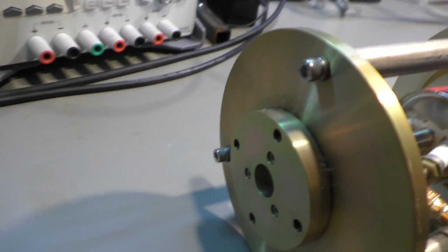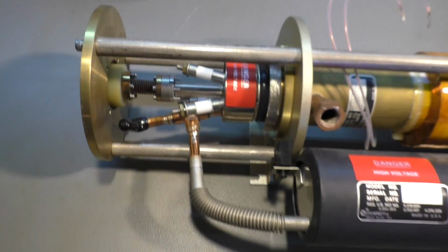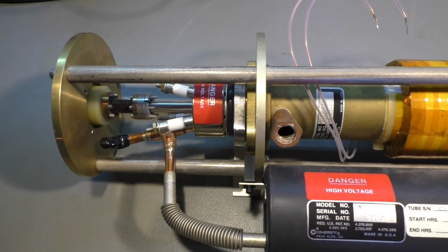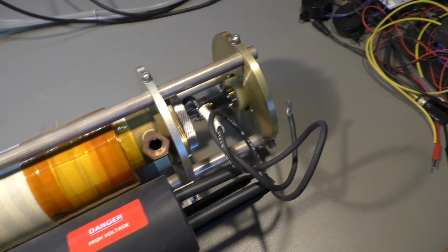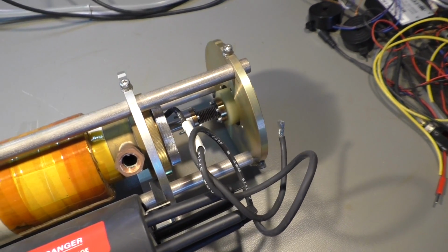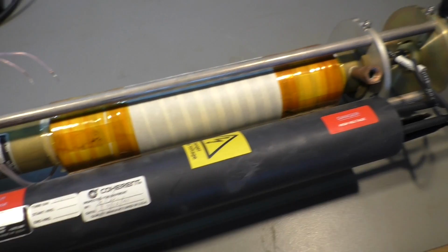There is of course a mirror on the other side. It looks about the same as the output mirror, but this one should be 100% reflective, while the output mirror is only partially reflective. It has to allow some part of the beam to go through and come out of the tube.